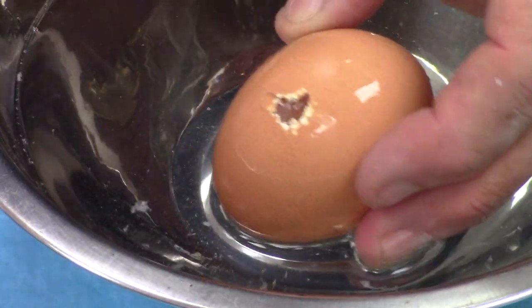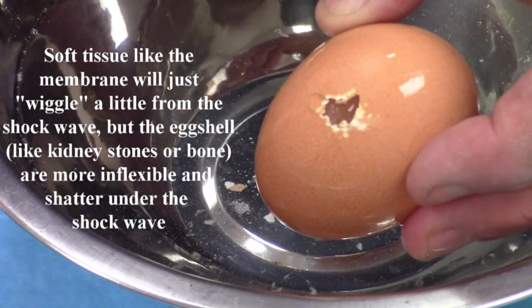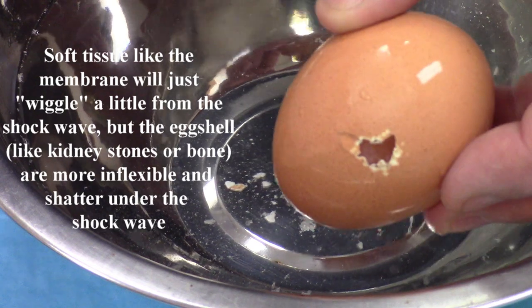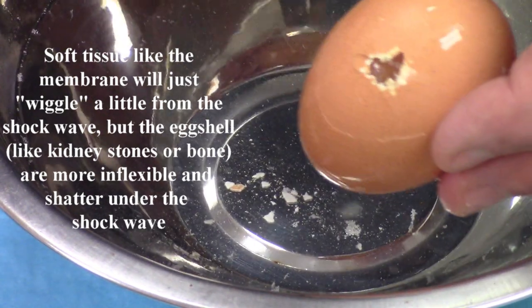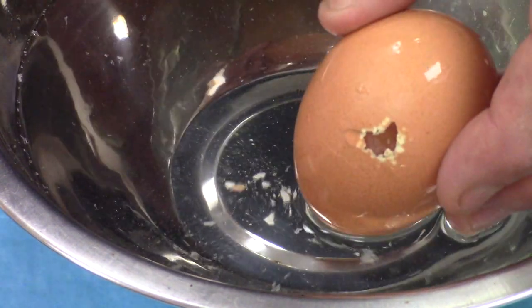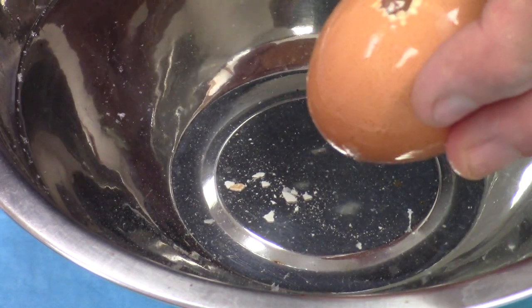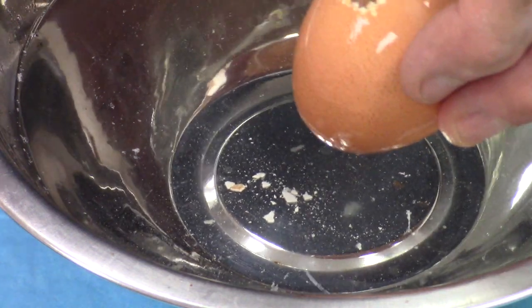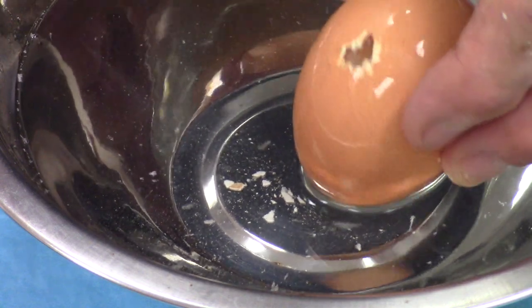So it fragments hard objects like the eggshell but it won't hurt the soft membrane underneath unless you physically poke that fiber right through there. This means a holmium YAG laser is good on hard tissue like bone and cartilage — to make osteotomies, to work in arthroscopy for cartilage in the knee and other locations, and in back work for the spine itself. That's using high energy and a low number of pulses per second.